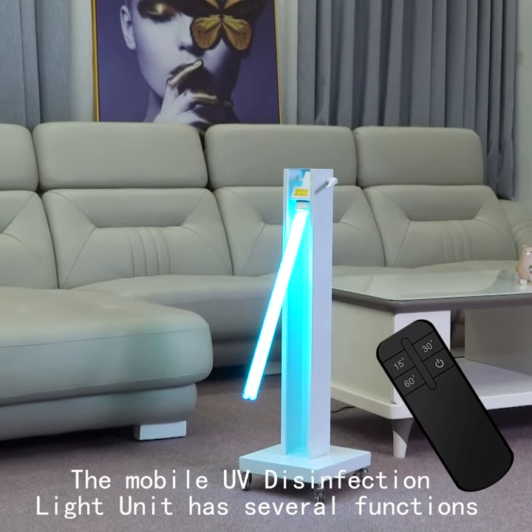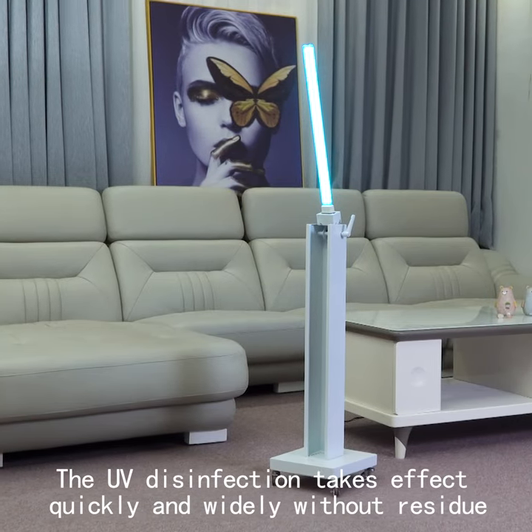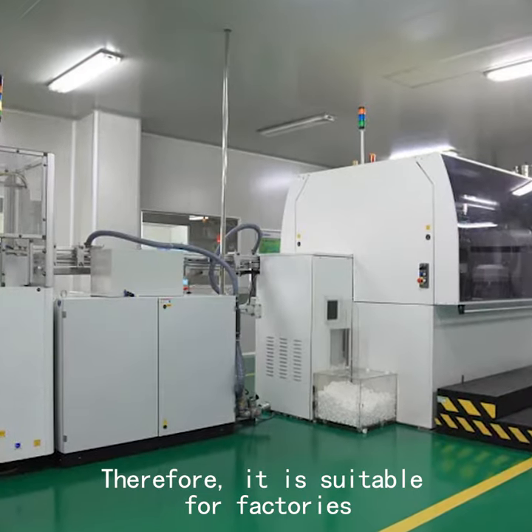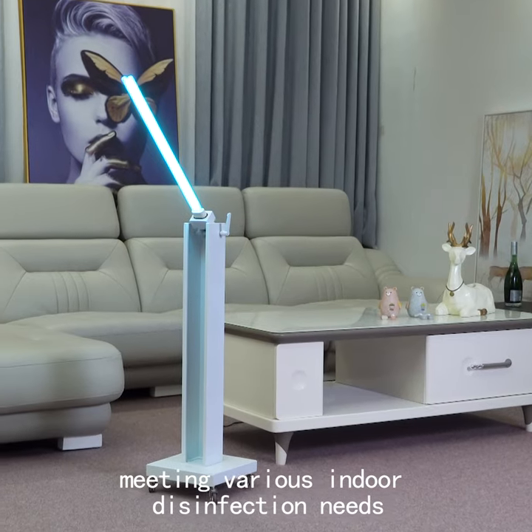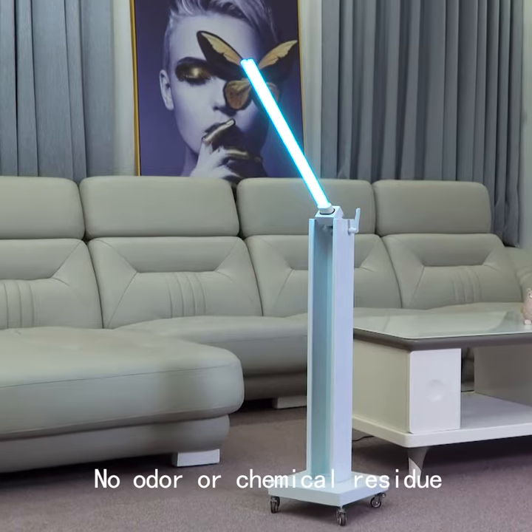We can choose one of the three modes. The UV disinfection takes effect quickly and widely without residue. Therefore, it's suitable for factories, kindergartens, schools, hospitals, offices, and other places, meeting various indoor disinfection needs. No odor or chemical residue.